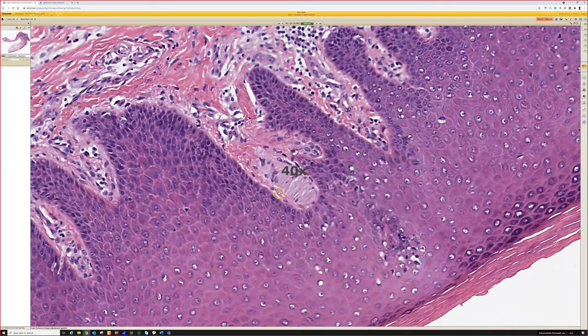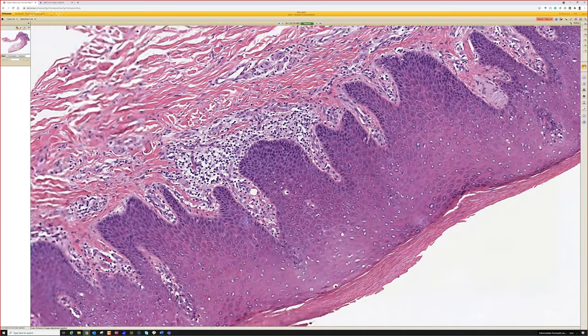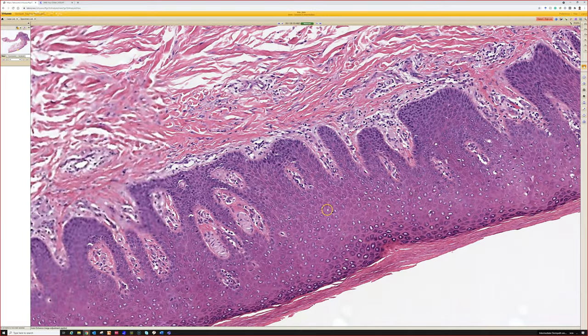Look at that. That's a Meissner's right there. I wish it was a little clearer, but it's in the papillary dermis, and it's like a little pink egg with little stripes. I think it's like a little Easter egg with stripes on it. Someone else told me once a cotton candy swirled on a stick. I like that too. That's pretty good. So, and these, because they're close to the surface, these are for fine touch reception, right? So that's Meissner's. Oh, and there's more.